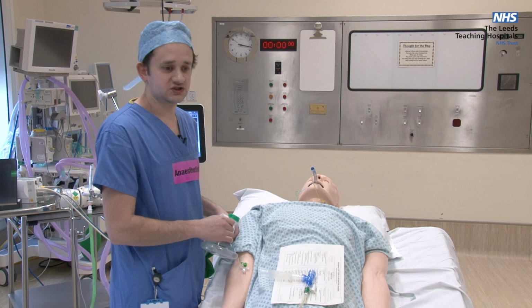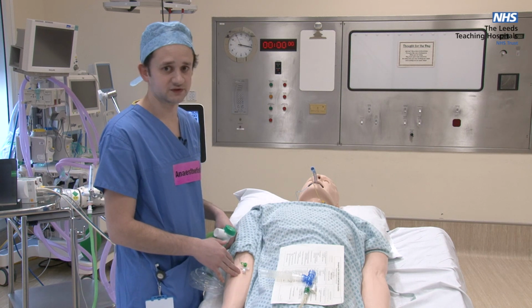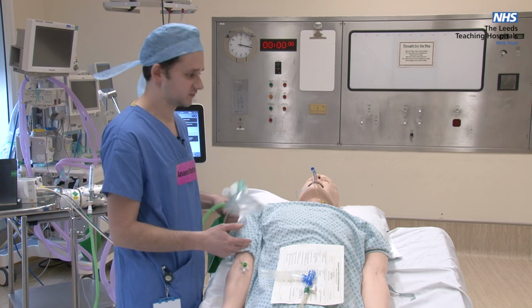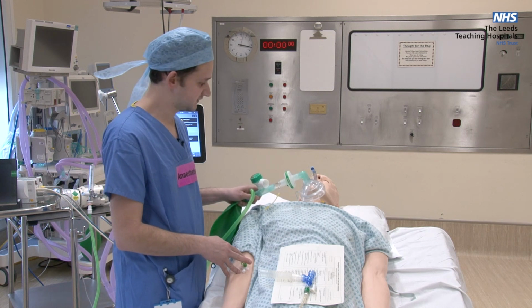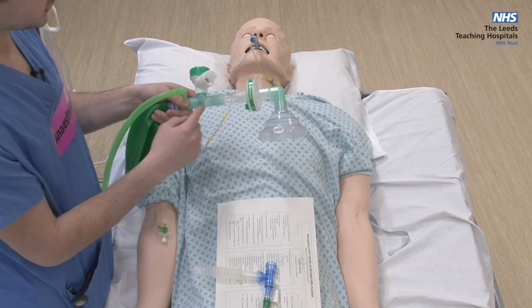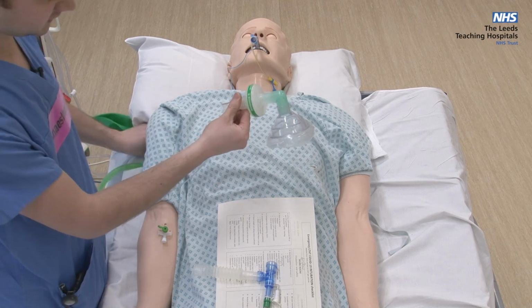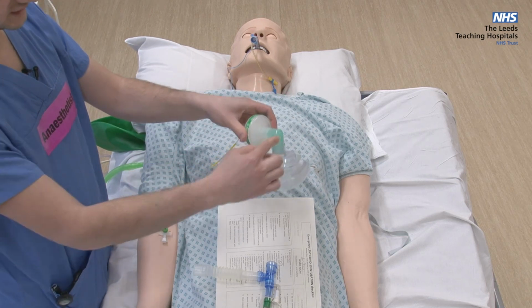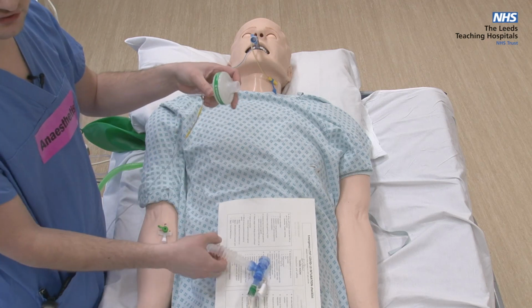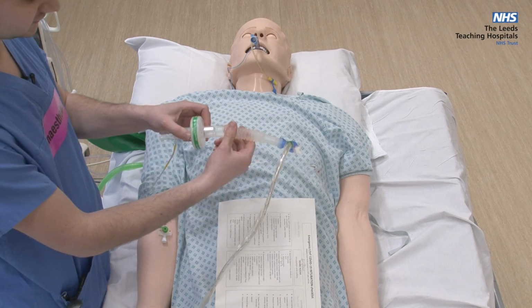Once the pre-oxygenation is finished, the drugs have been given, and the muscle relaxant has worked, the intubator will intubate the patient. When the Mapleson circuit is taken off the patient's face, it will be passed to Assistant 1. Assistant 1 needs to then detach the Mapleson circuit from the capnography like so, and they also need to remove the face mask and the angle piece. This then needs to be attached onto the closed circuit suctioning so that the filter attaches onto the extension piece of the closed circuit suctioning like so.